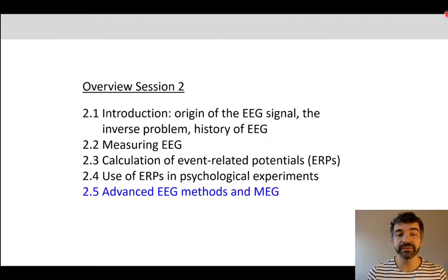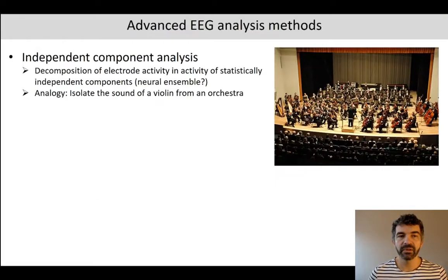For the remainder of today's session, we will be talking about advanced EEG methods and MEG. One advanced EEG method is the independent component analysis.